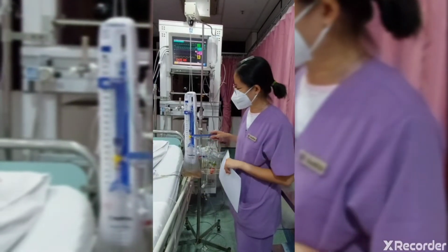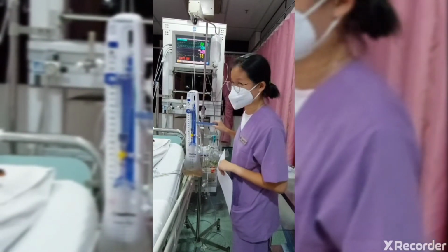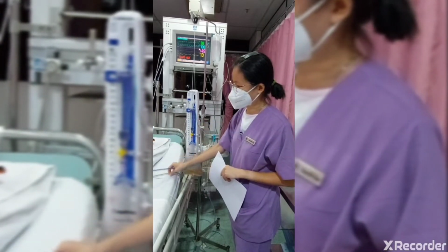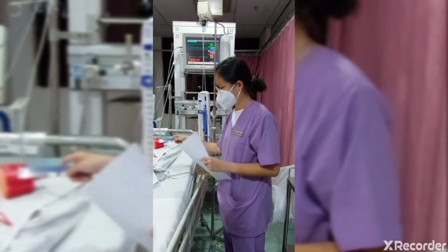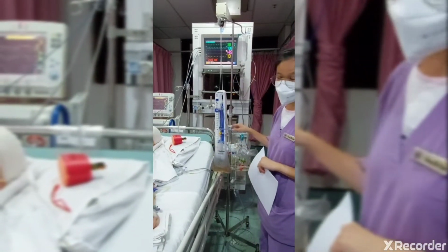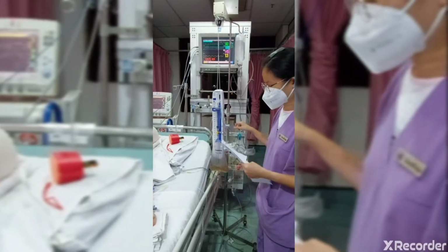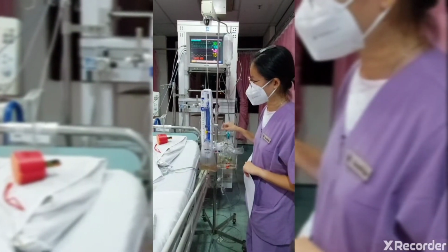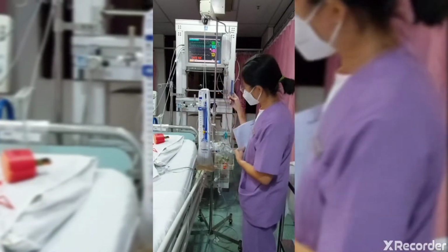Before I do the demo, I would like to introduce this EVD set. This is the external ventricular drainage system. This is the intraventricular catheter, inserted through the brain and through the lateral ventricle, to drain out the CSF. The indications for the EVD system are for patients with head trauma, hydrocephalus, cerebral edema, and intraventricular hemorrhage. Okay, now we go to the monitor.